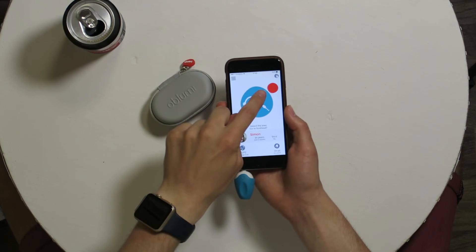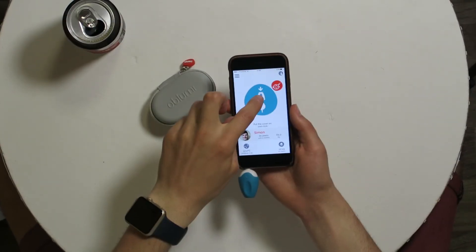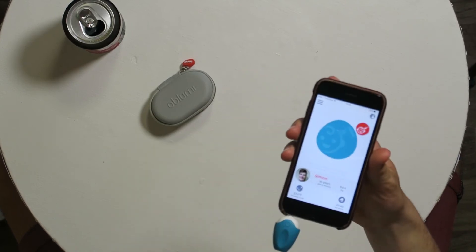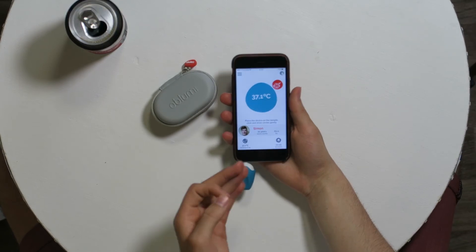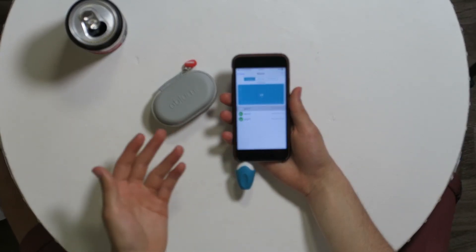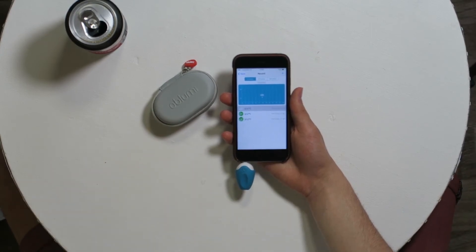One more time, let's measure my forehead. Click for forehead mode, cover on, click again — and it measures very fast: 37.1°C. So across three measurements I got 37.3, 37.2, and 37.1 — each time very close and almost the same, which means the device works very well.